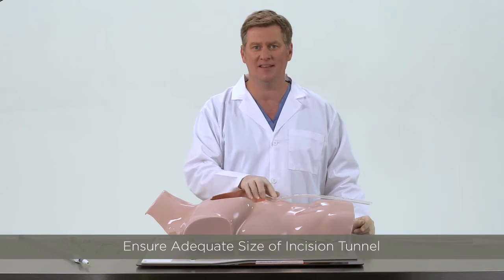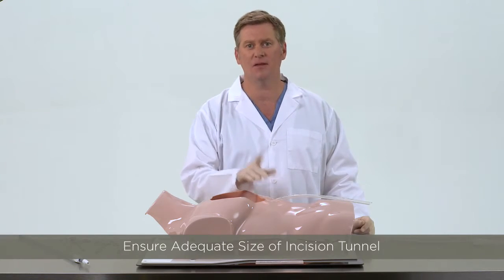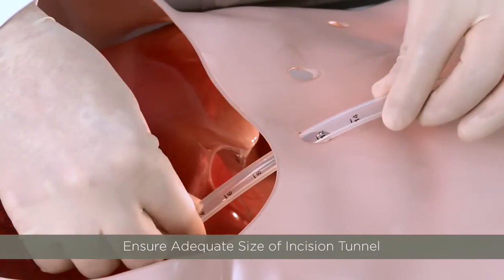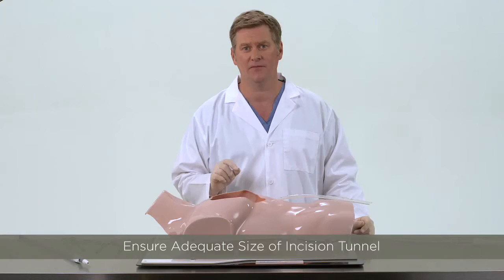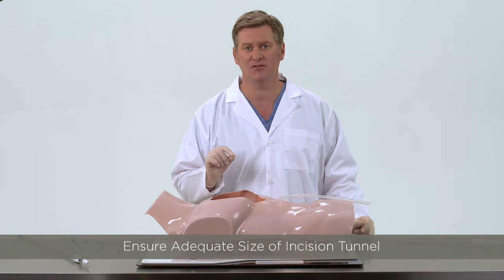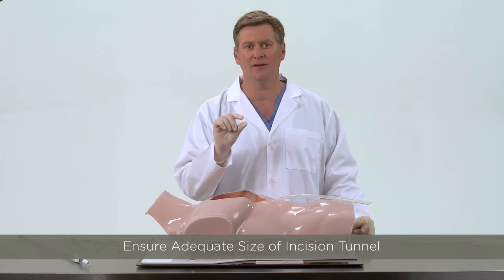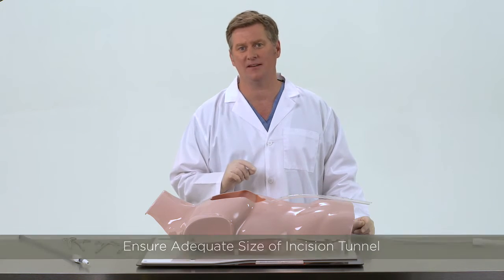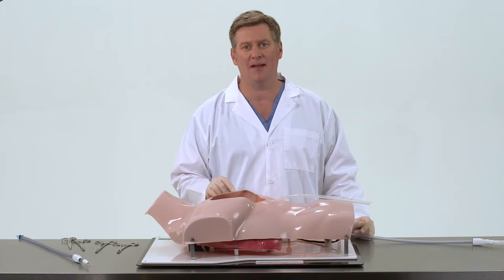When you create the skin incision and tunnel the chest tube, make sure the chest tube tunnel is of adequate size so it does not kink or dimple the silicone tube. If the incision tunnel is smaller than the French diameter size of the tube, it can cause a dimple of the lumen that can prevent the clearance wire and loop from advancing or retracting. This will result in magnetic safety release at the skin level.